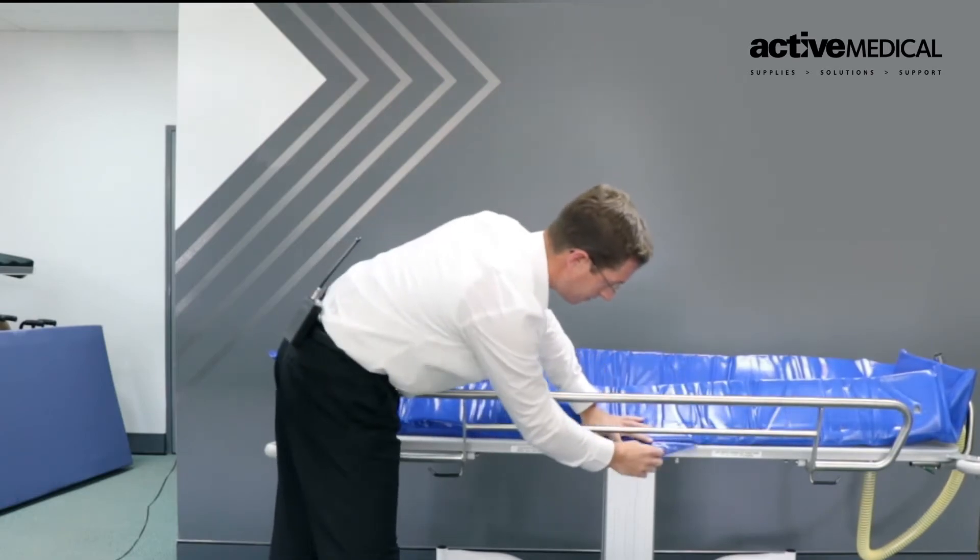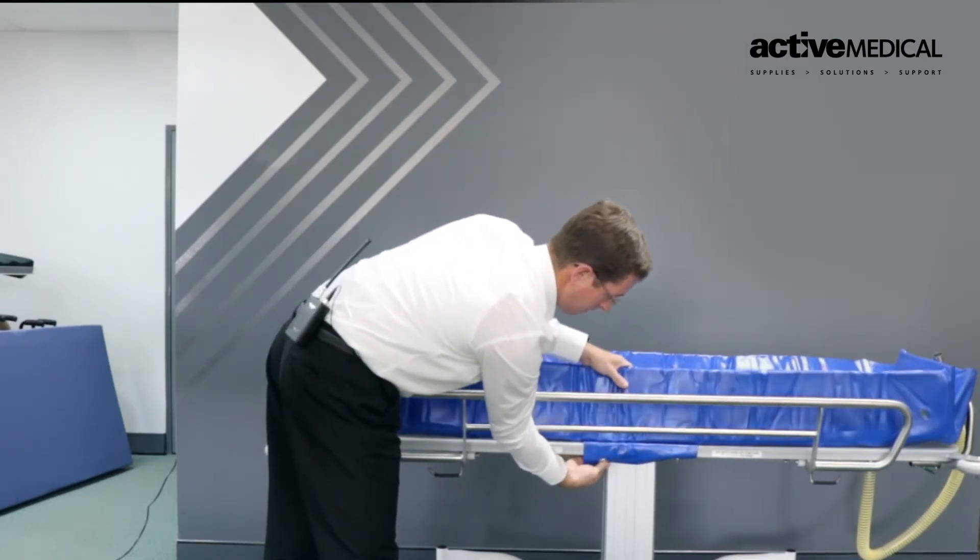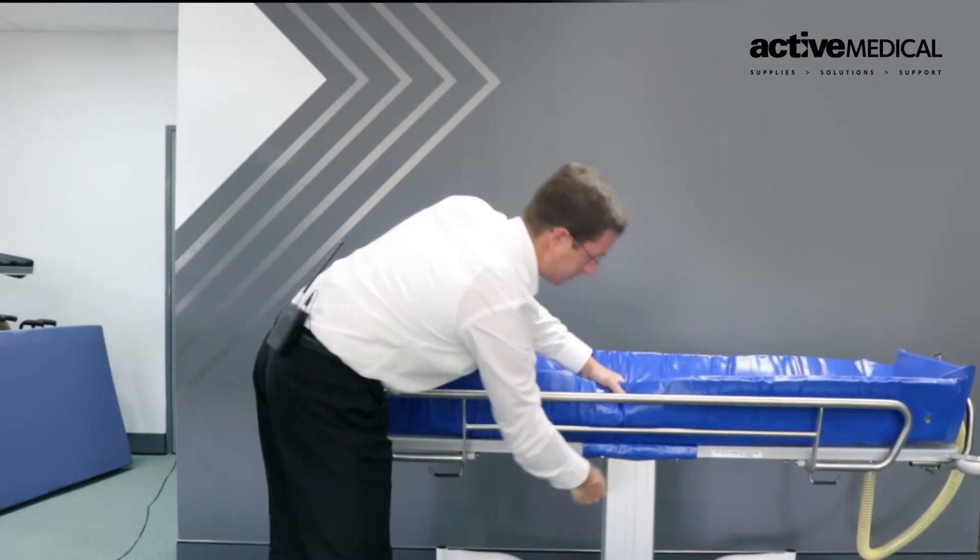The liner can be cleaned and set out in the sun or in an open-air place to freely dry. Simply clip it back on and ensure it is locked into place.